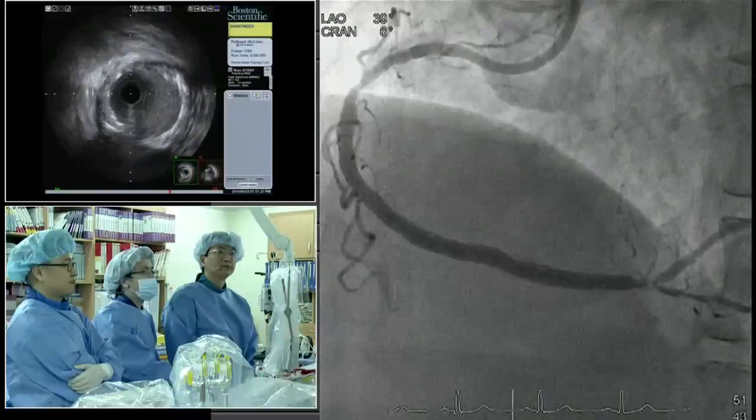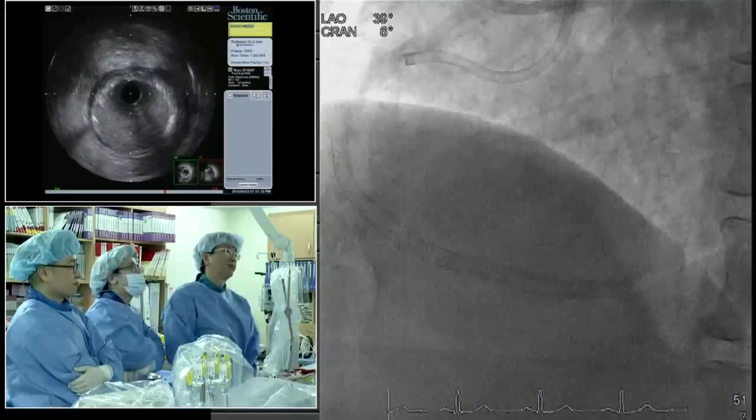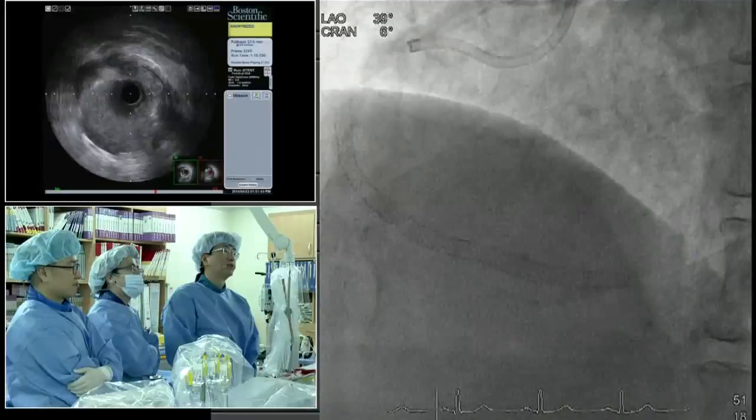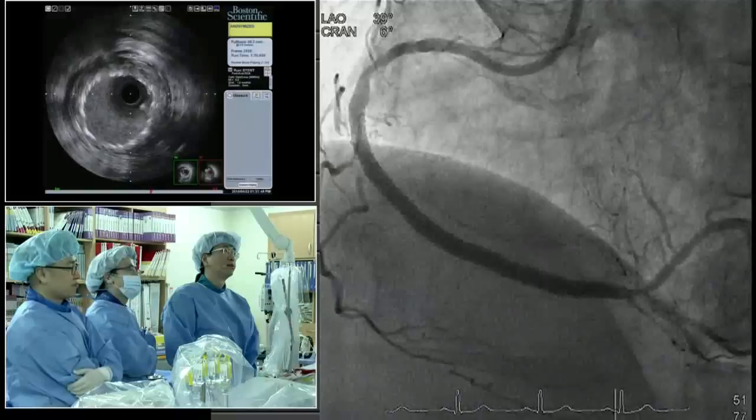Proximal. Okay, well, proximally, I probably would not leave it. I think there's a lot more disease up in the proximal vessel. Yes, you're going to end up having stenting almost the entire vessel, but I think if you leave it like there, particularly at the tip of the guide, I think there's a dissection. Let me hear from another panel member what to do distally.